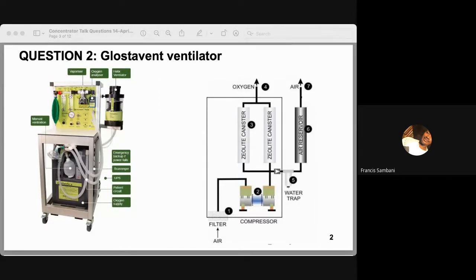This is because when the flow meter for air is open, one limits the amount of air going to the sieve bed, which leads to less pressure build up in the sieve beds and eventually low purity of oxygen. This should explain why the oxygen concentrator was producing low purity, even though it was fixed and was left to be okay.